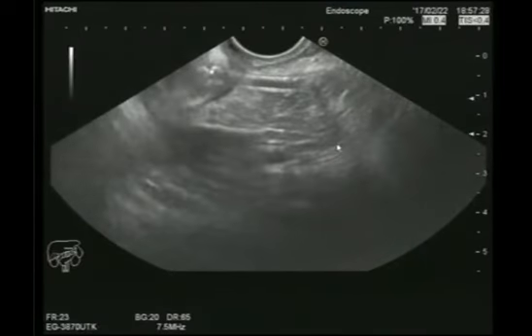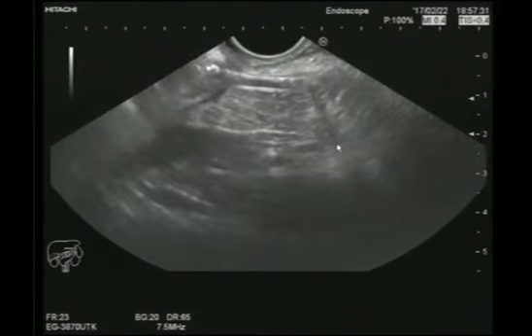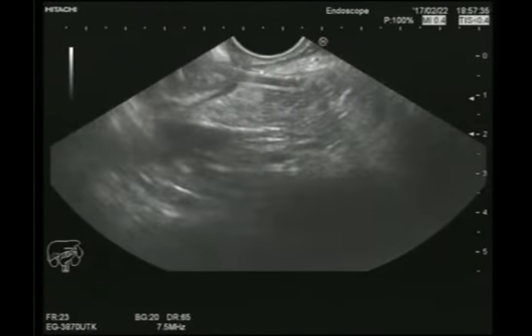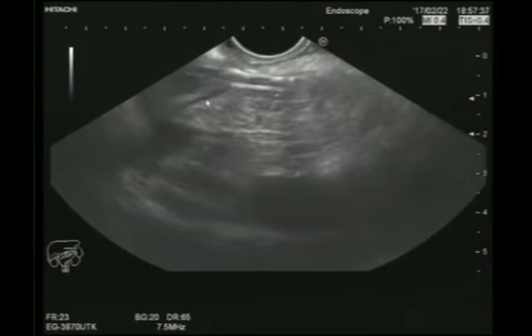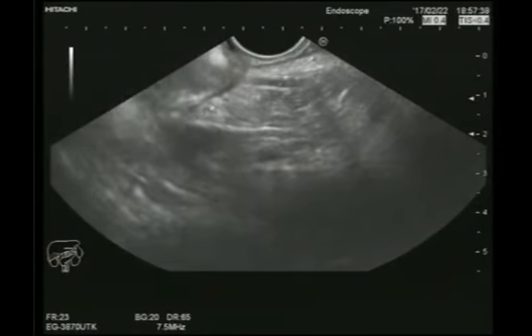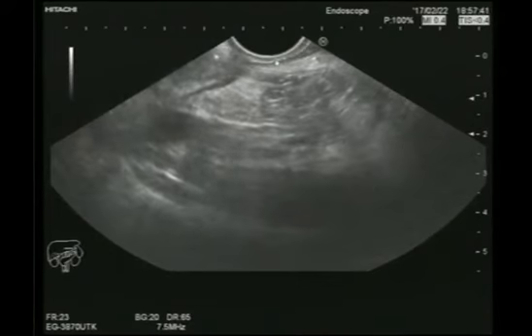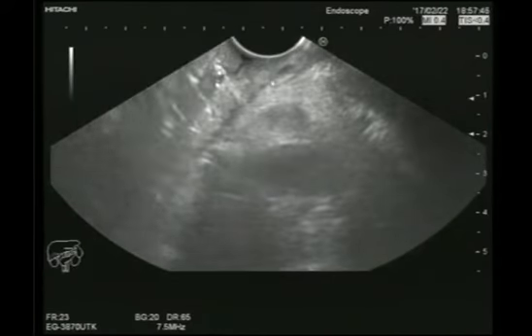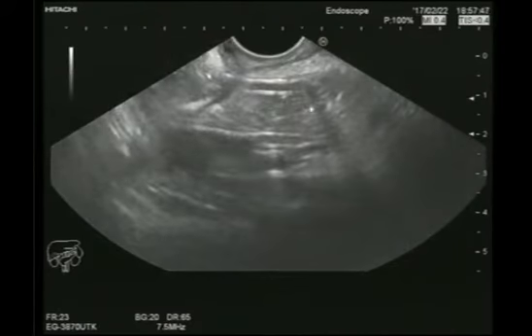Now Professor Okasha will show you the muscularis propria. Here you see it is continuous, yes, and the stent is protruding from the common bile duct into the second part of the duodenum.